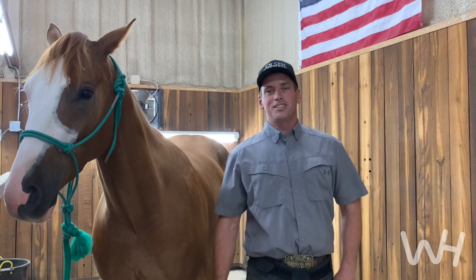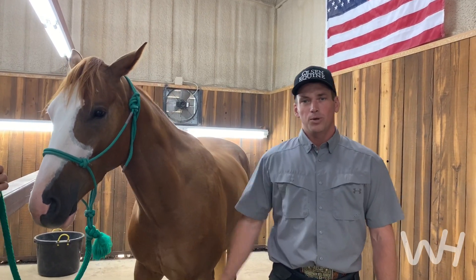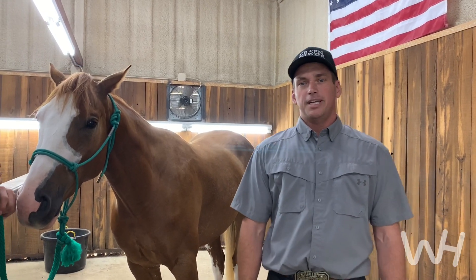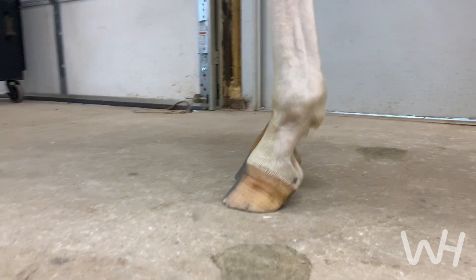Hey, I'm Lee with Olsen Equine. Today we've got a really interesting case. This is a three-year-old that a client just bought, a really nice cow horse, and he is 100% sound, but while doing the pre-purchase x-rays, the vet was concerned about the bony column alignment, and they asked me to take a look at it.